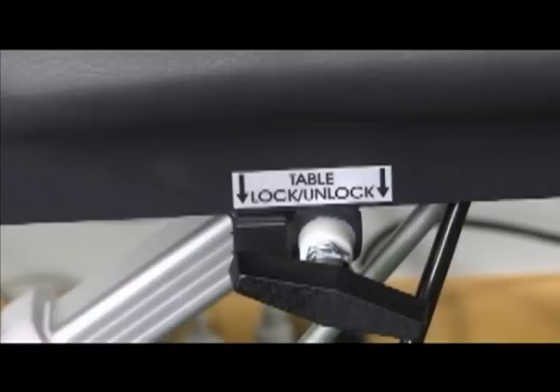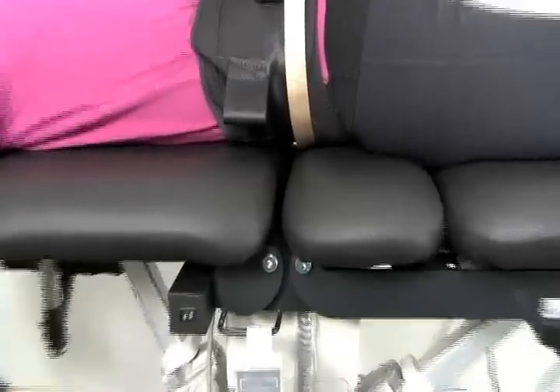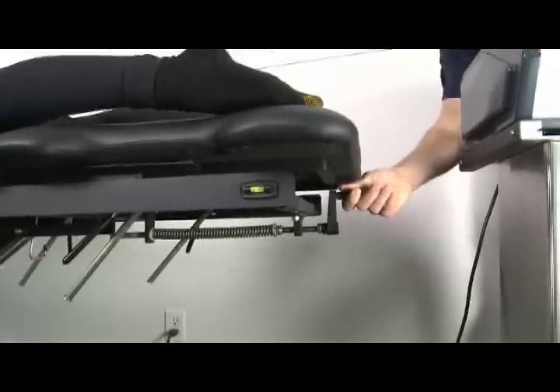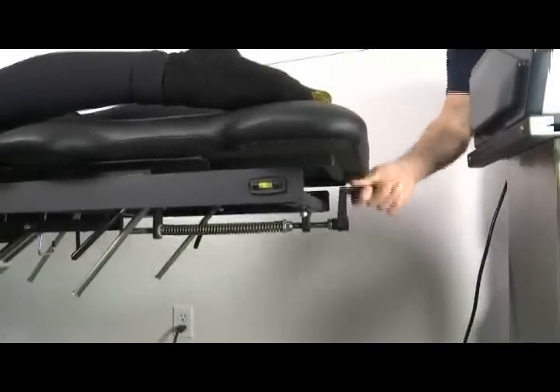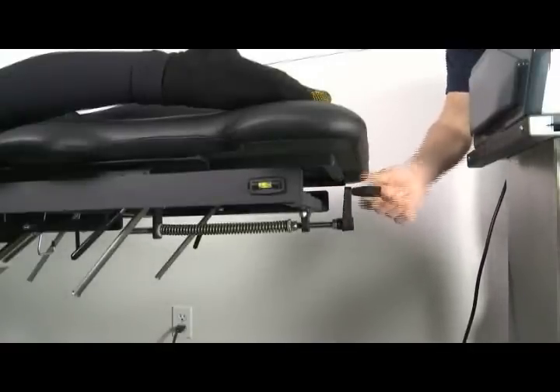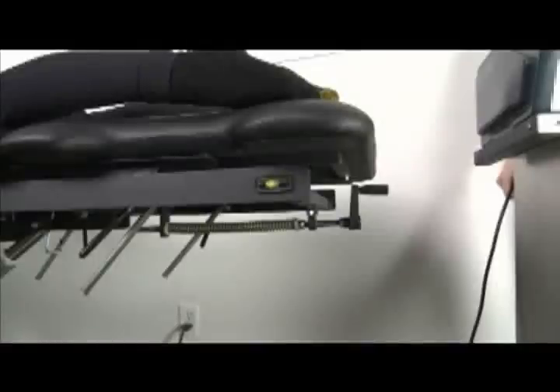After unlocking the table, observe the split of the table between the upper caudal section and the lower movable section. The table should open approximately a quarter of an inch at peak force and close the same amount at rest. The table tension retraction spring is controlled by the hand crank at the base of the table. Fully tensioned, the table exerts approximately 50 to 55 pounds of retraction tension to the table and the patient.